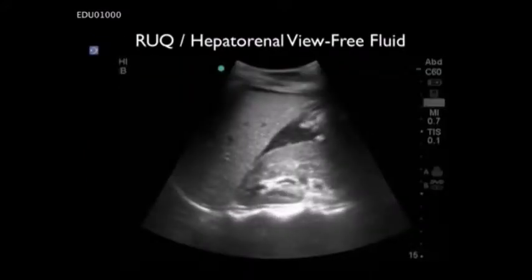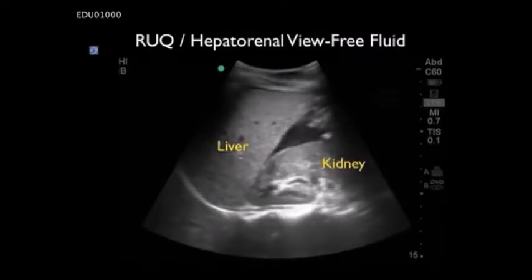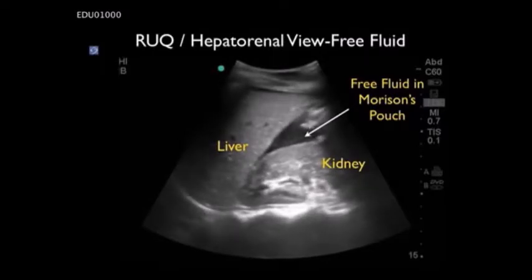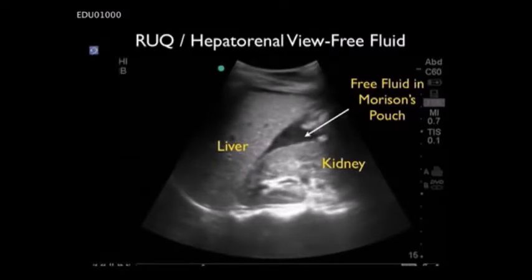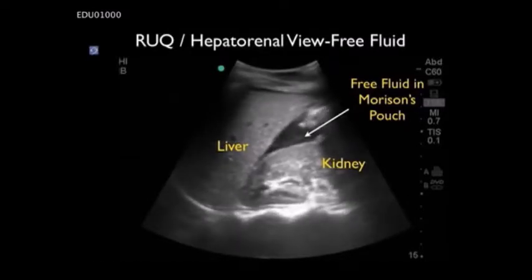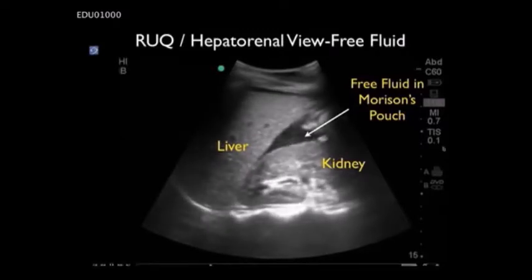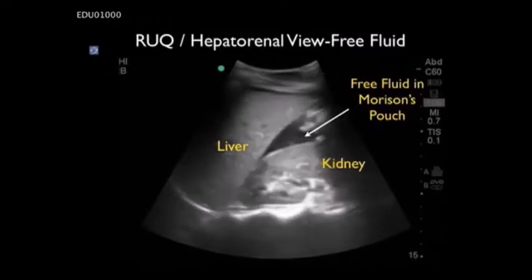While the RUSH exam is not specifically designed for the evaluation of the trauma patient, occasionally a patient may present as a delayed presentation of trauma or after occult trauma with this positive finding. In this situation, a surgical consultation and possible operative repair for an injury to an internal organ may be indicated. In this view, we have a positive right upper quadrant exam with free fluid in Morrison's pouch.